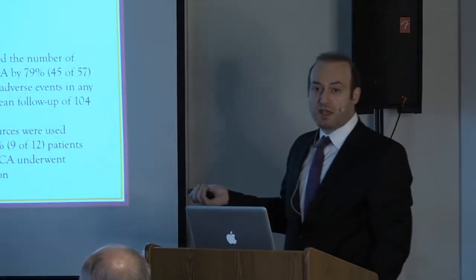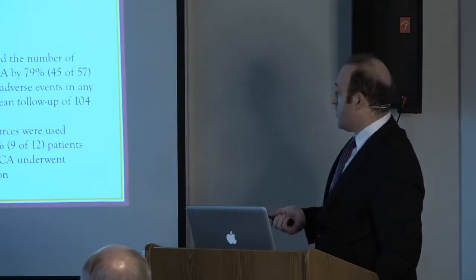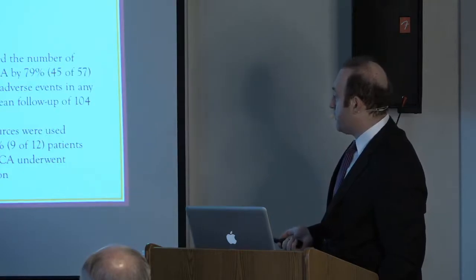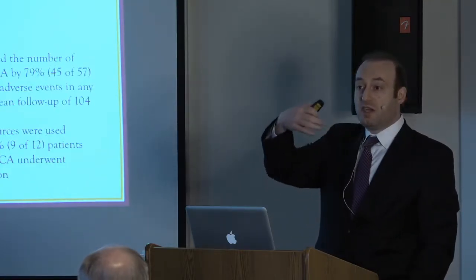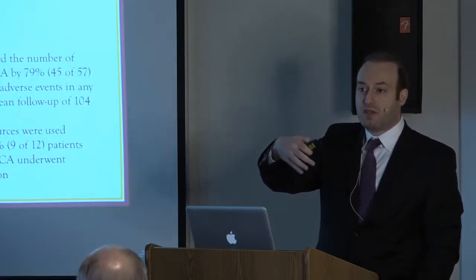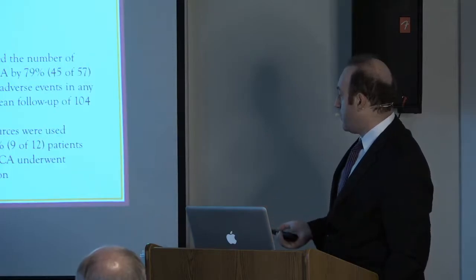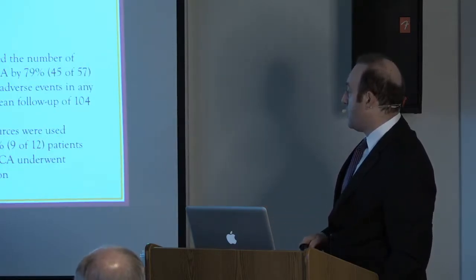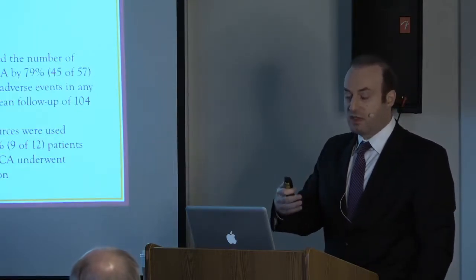And this next stat should resonate with a lot of the interventionalists in the audience here. Cath lab resources were used efficiently. And what I mean by that is the majority of the patients that we're studying in the cath lab are getting appropriate revascularization, right? So in this particular presentation, 9 of 12, so 75%, underwent revascularization at the time of the cath.